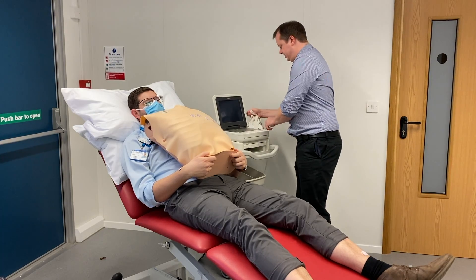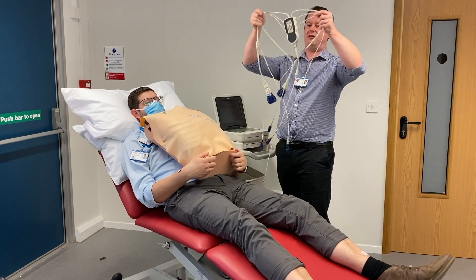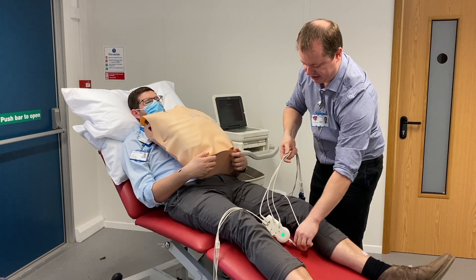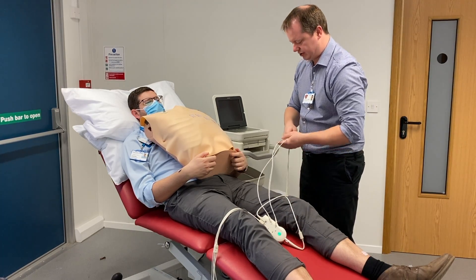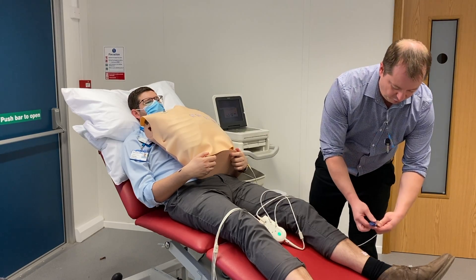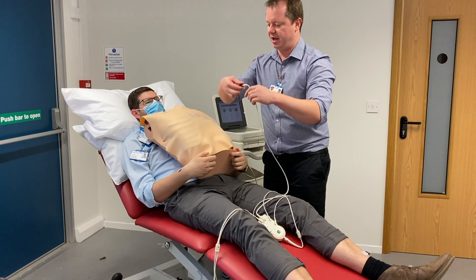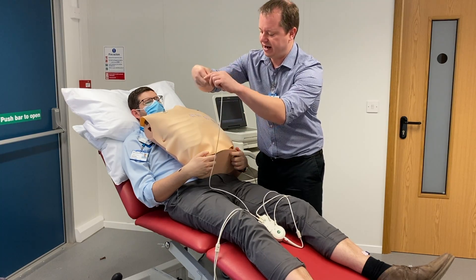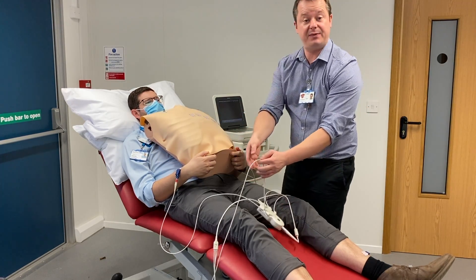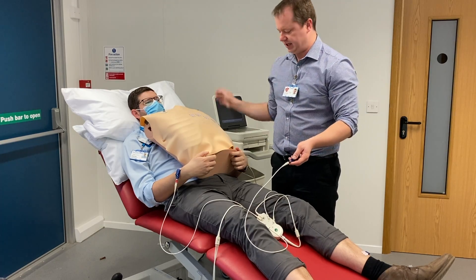We want to place our wire block at about knee height on the average patient, and then we connect our wires to the patient in the right places. The limb leads have an order - luckily the block is set out in the correct order. The red limb lead goes on the right hand, then yellow, green, and black. An easy way to remember it that a lot of healthcare professionals use is 'ride your green bike' - red, yellow, green, black.